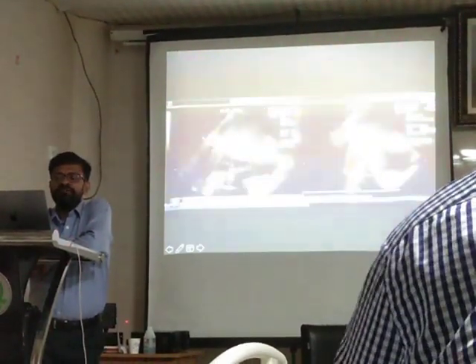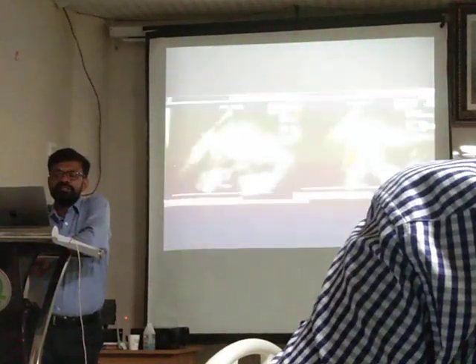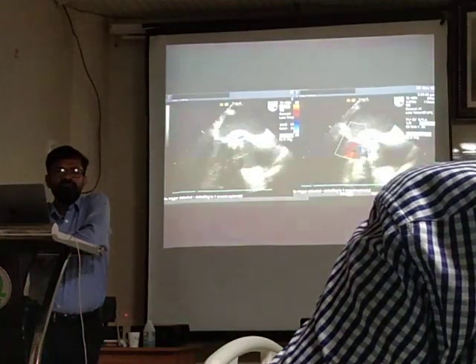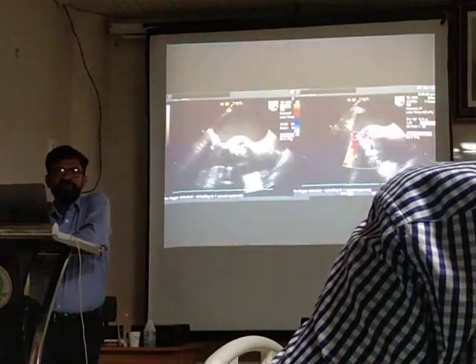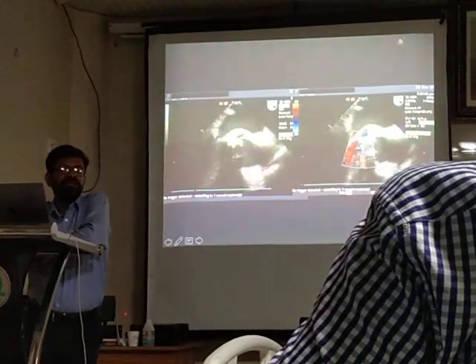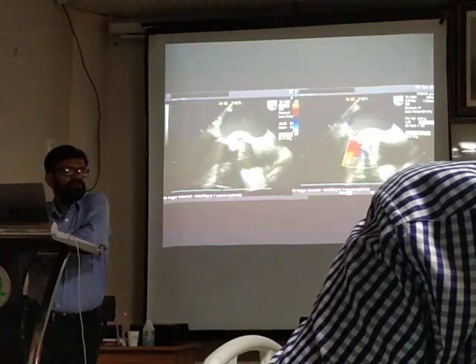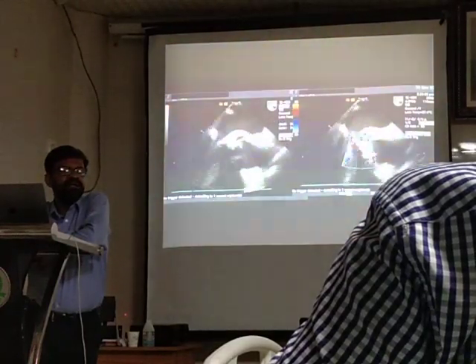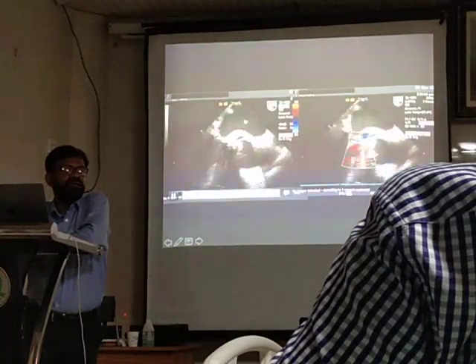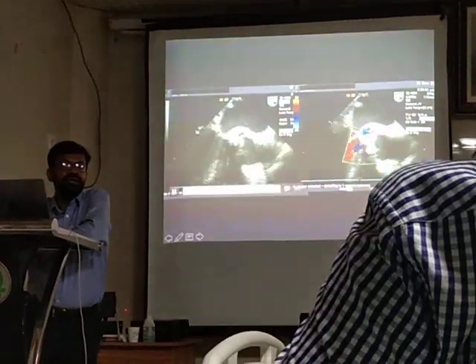This is aortic valve, this is mitral valve, right? Let me diagnose. Prosthetic mitral valve. There is something going on. Now my question to you is, black color in echo means what? Black color in echo. It's a black object. What is it? Blood. It's blood. Right?